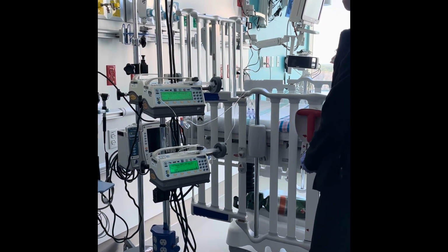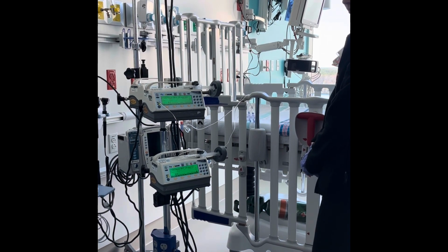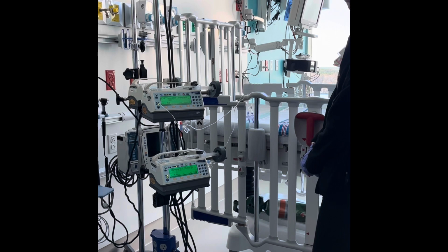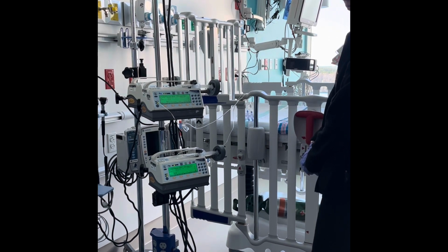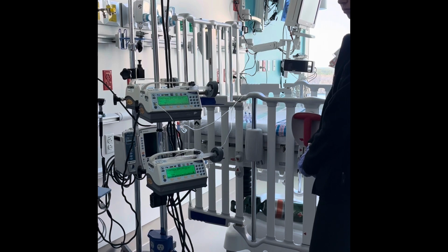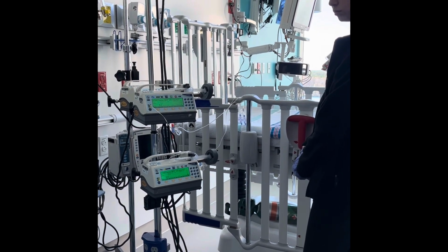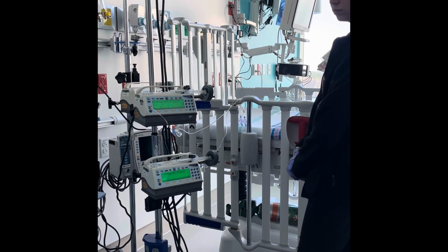Complete this procedure with all infusions that are infusing on the same port manifold, only doing 1 infusion at a time if multiple changes are required. For the purpose of this reliable method, we'll be using epinephrine, norepinephrine, dopamine, or vasopressin as a standard for double pumping in our unit.